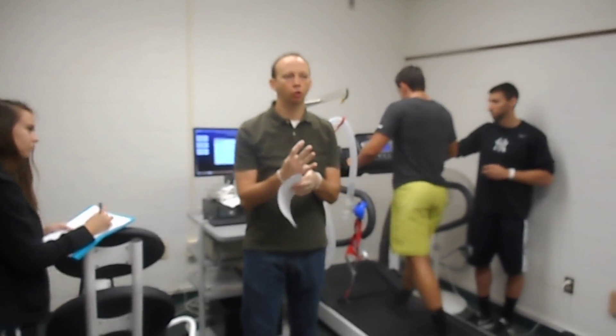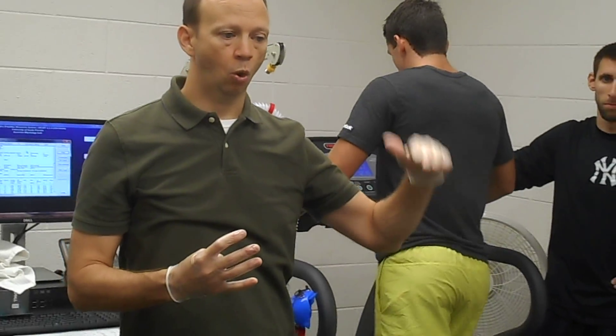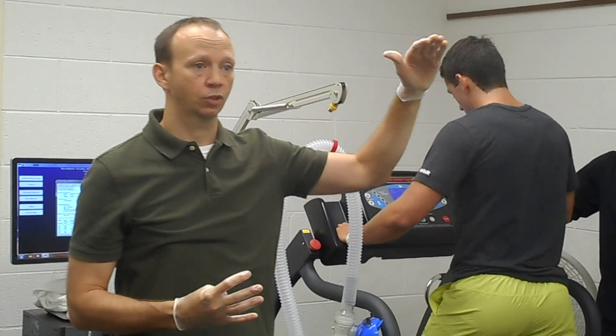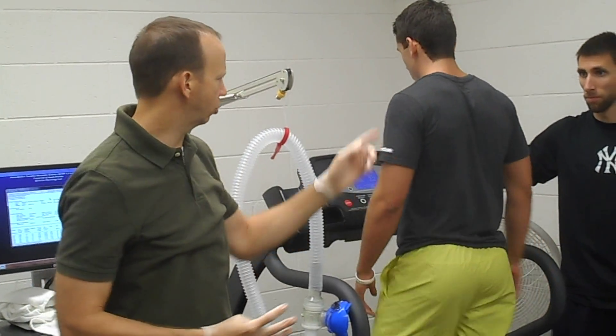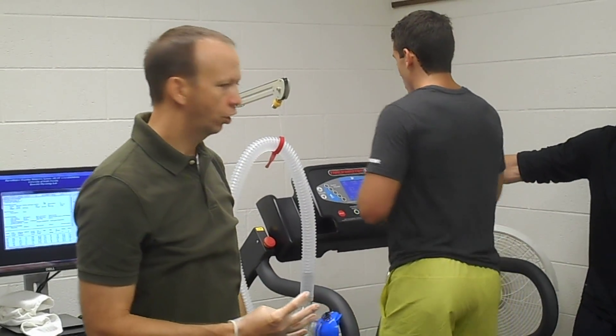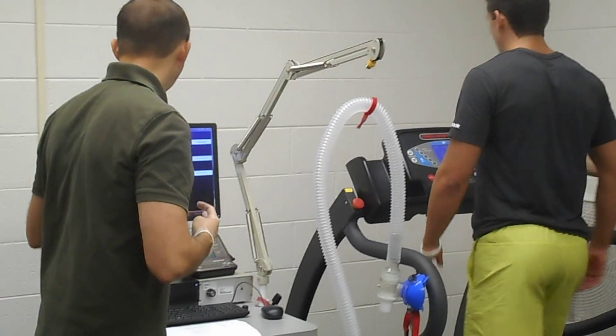Before looking at VO2 itself, we assess whether Zach gave a max effort. Heart rate: we want to be within 10 beats of the age-predicted max, or within 90% of it. For a 20-year-old, age-predicted max is about 200. Within 10 beats means we want at least 190; 90% of 200 is 180. His highest heart rate met at least one of those thresholds. The respiratory quotient was 1.26 — we minimally wanted 1.0 and preferably 1.15, so he passed both indicators.